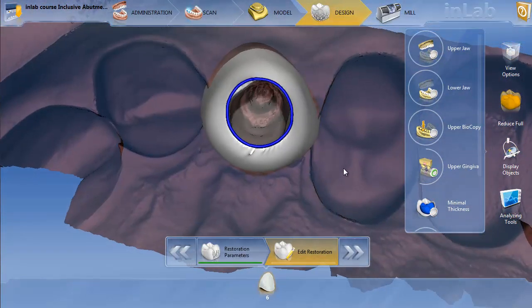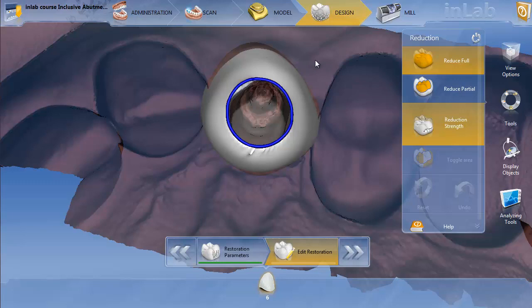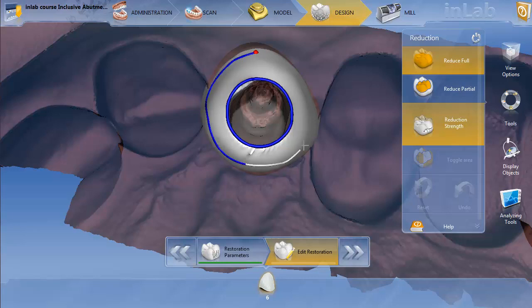We're not going to spend a lot of time with the initial line, but you can see — even though it defaults to reduce full — if I put the cursor over the top of the restoration, you have the crosshairs. Now we can double-click and we're just going to initially draw a margin around the inside surface of the restoration here.